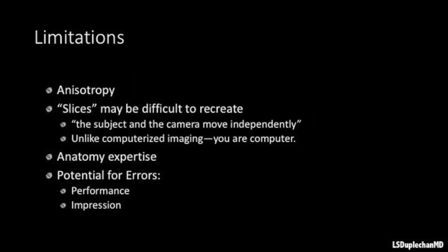Limitations to ultrasound include anisotropy, which we will discuss in detail later, in addition to expertise in anatomy, as well as the potential for errors in both performance and impression. We will start with some of the echo terminology.